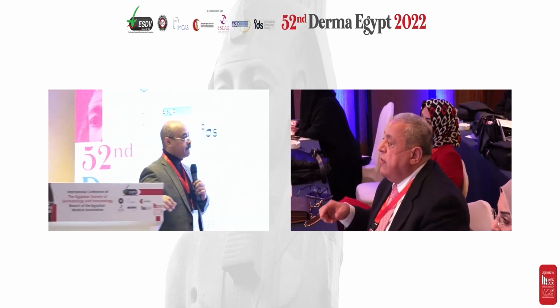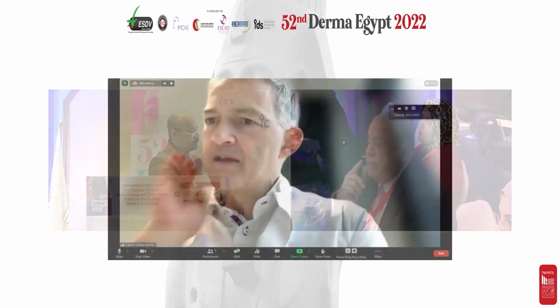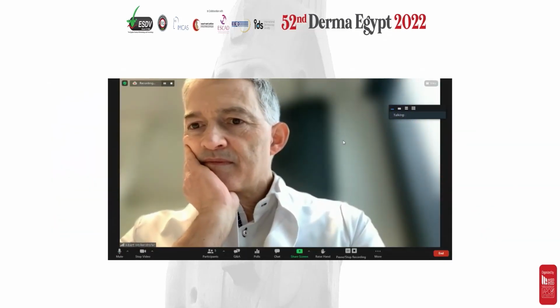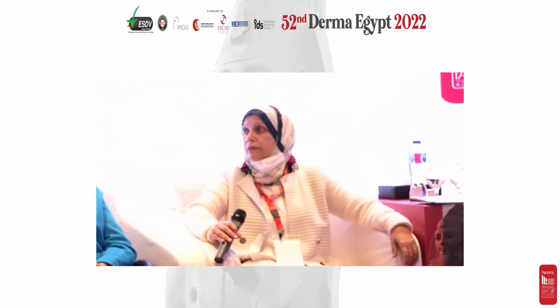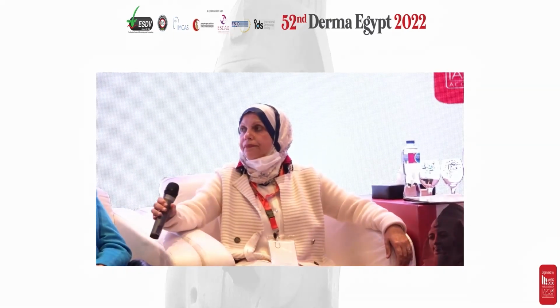I'd like to comment on using the smoke evacuator with hair reduction. A paper was recently published showing that the particles evacuated into the air are carcinogenic. So it should be used. There are 62 compounds which are carcinogenic and toxic in the plume of hair removal, so it has to be really taken care of.